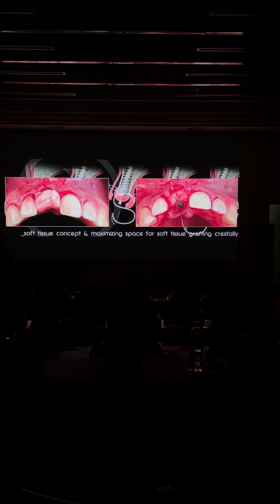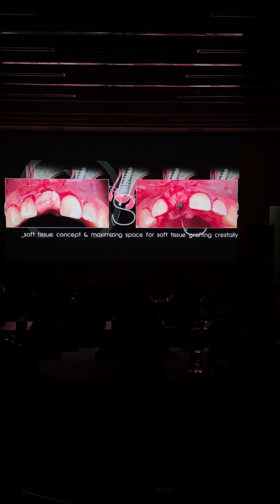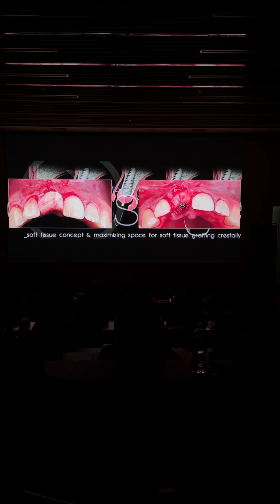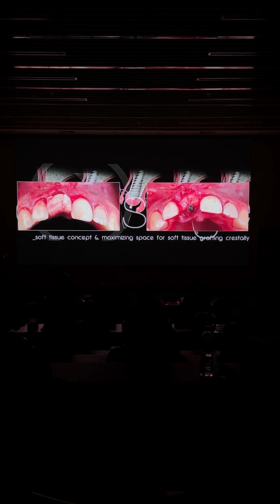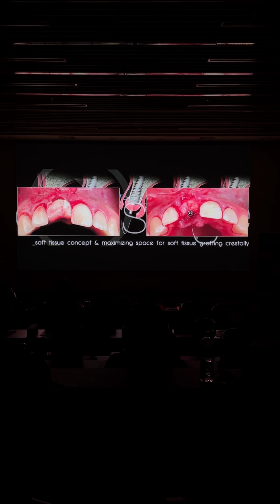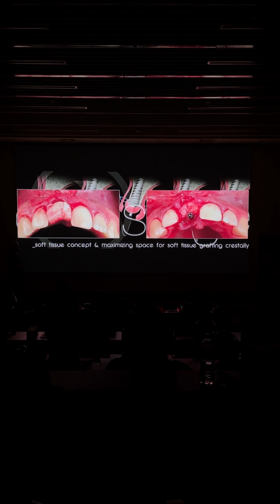So we have many cases. You see this one. What is important? Many dentists that come to our courses calculate a soft tissue that is too narrow. And what we want is that the tissue fits the mesiodistal aspect of the tooth you are replacing. So this way you are able to support the interproximal papilla in one shot. So you can see that if you are too short and not touching the adjacent tooth, you won't support the papilla in the same way.